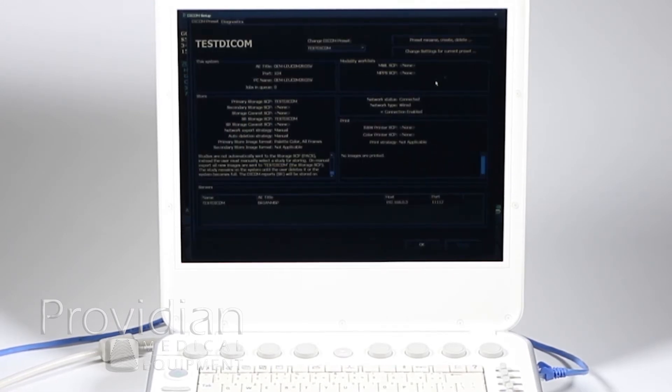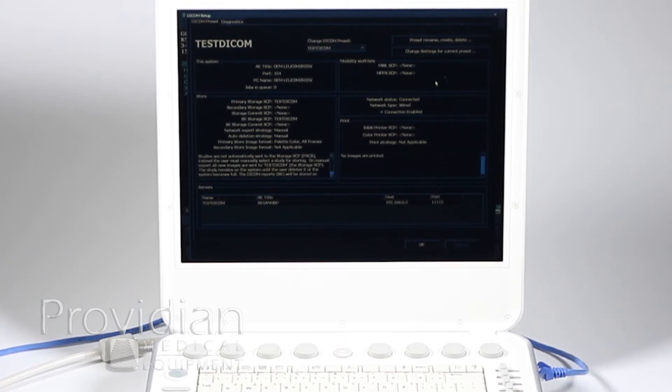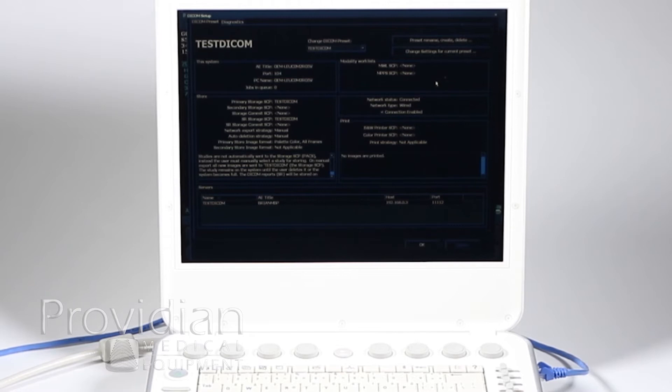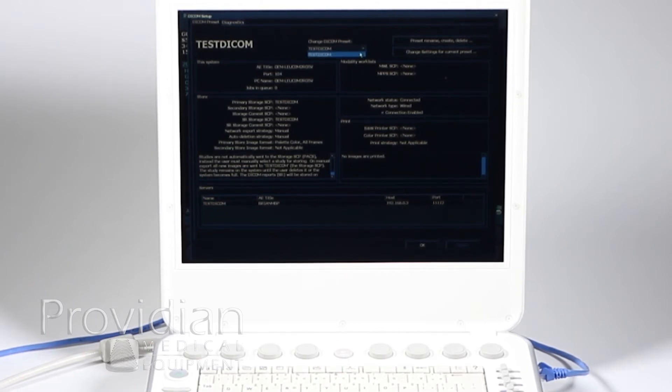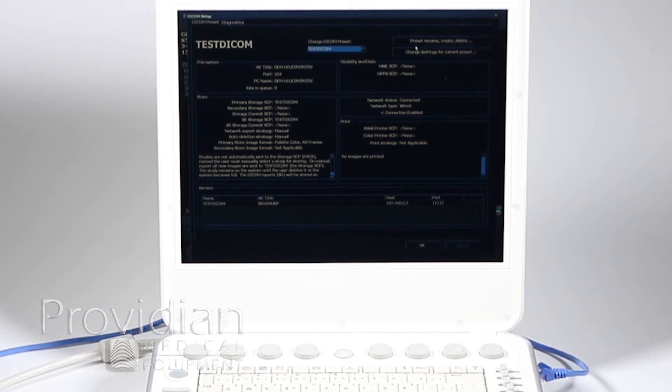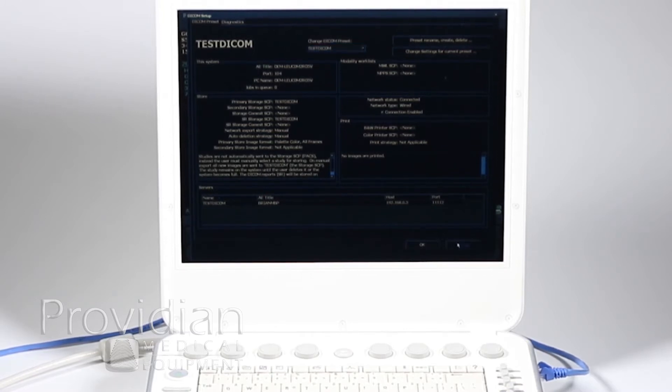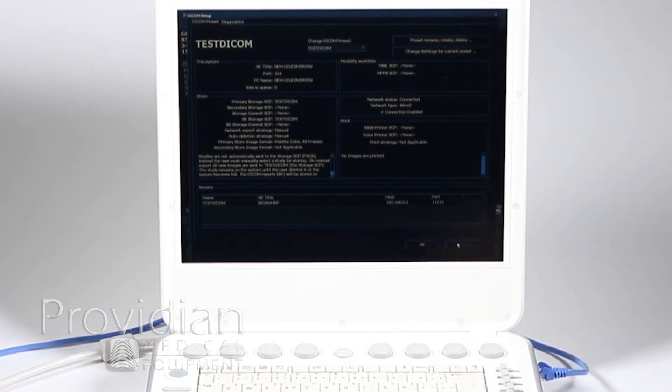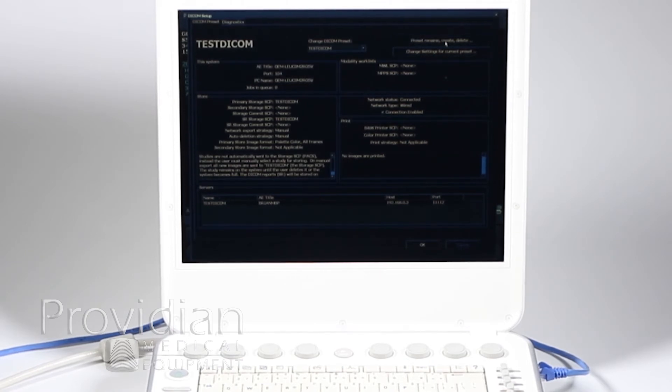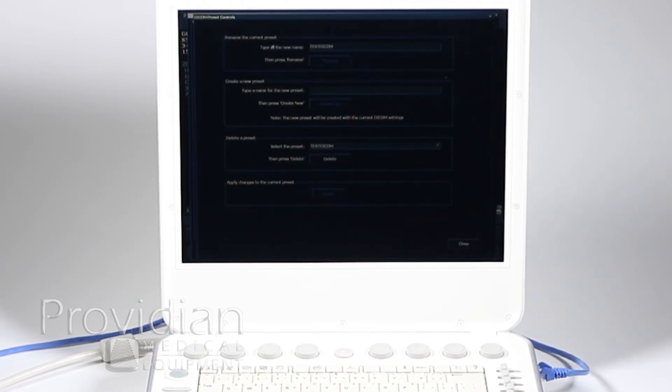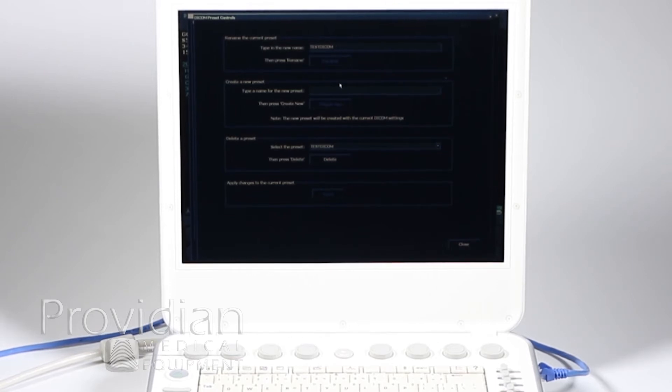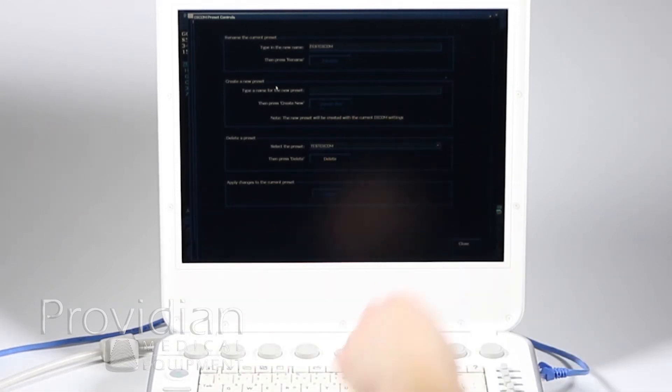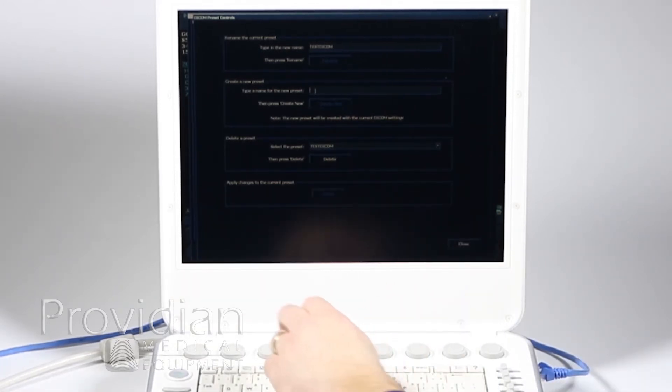Then you're going to go over and click on the DICOM button. You'll get a screen that looks really confusing and intimidating. You may already have a preset installed, but it's probably not right for your system. You'll go up and click the preset rename, create, or delete. We're going to create one. I don't want to rename the current preset. I want to create a new one, create a new preset right here.